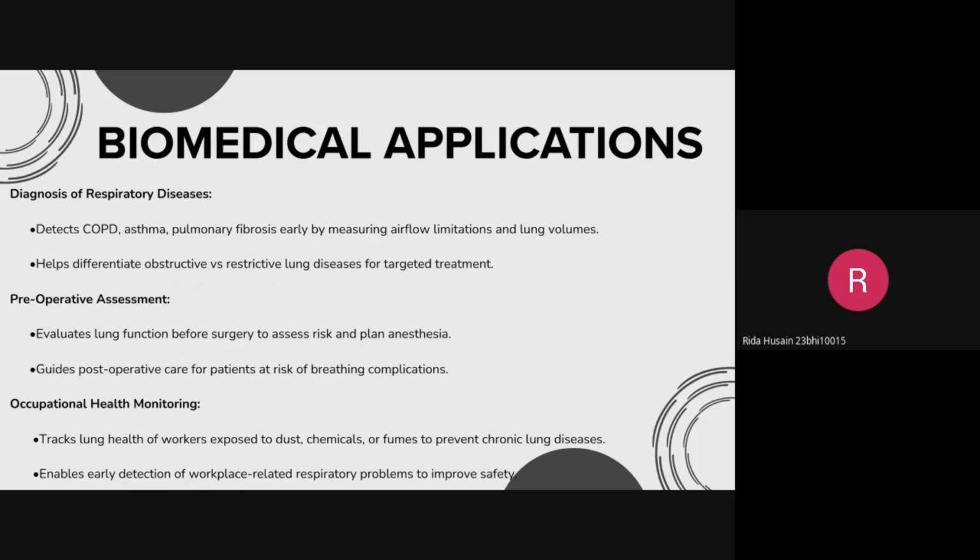Next is occupational health monitoring. It tracks the lung health of workers exposed to dust, chemicals, or fumes to prevent chronic diseases. It also enables early detection of workplace related respiratory problems to improve safety.